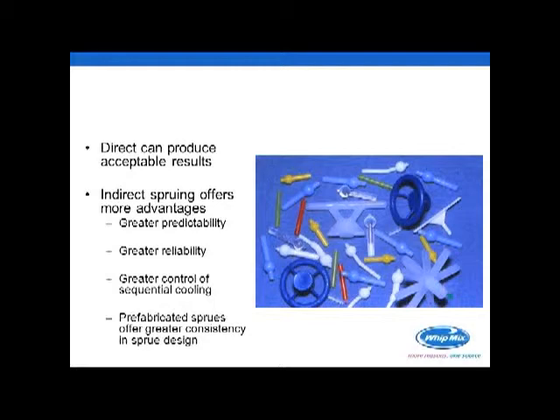And there are different sprues that are on the market, but take a look at the ones that you have. If they're solid plastic, that might be problematic. If they're hollow plastic, you probably can get away with that. I had good success with those that were from the Diequip Corporation over the years. But take a look at your spruing system and see if that's contributing to any of the problems that are out there.